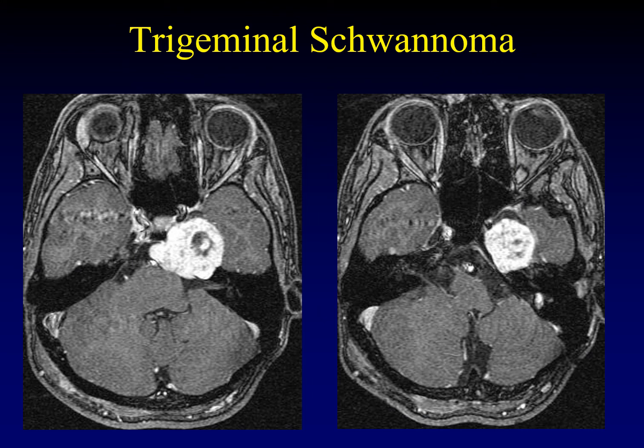At first glance, you might look at this lesion and say to yourself, that is classic for a schwannoma. It has a spherical configuration. It's got that heterogeneous enhancement. It's expanding stuff around the petrous apex. It looks just like a schwannoma, and it is a schwannoma. It's just in the wrong place, right? It should be here, centered on the porus acusticus. Instead, it's anterior. Where exactly is it?